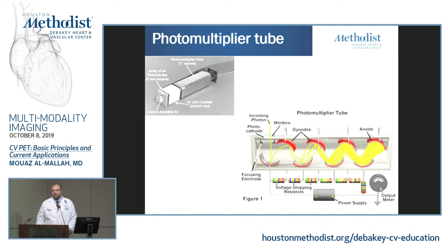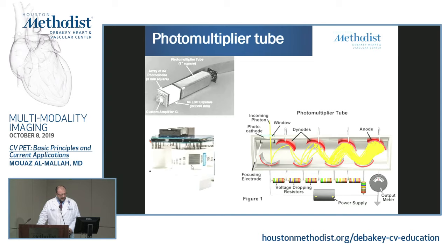And these are like the old machines. Now, the newer systems, which we have, instead of having a regular photomultiplier tube, which breaks more often and gives you a harder time, especially on the SPECT system, now we have the electronic and digital.